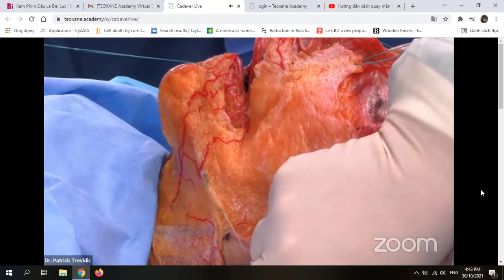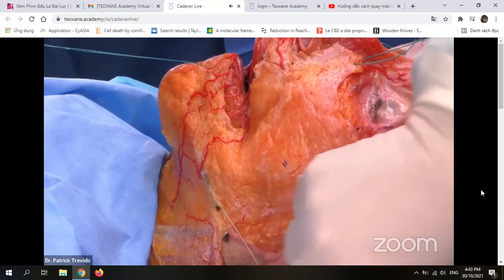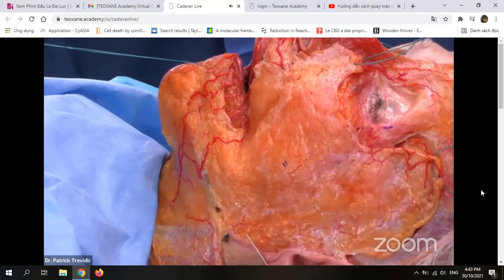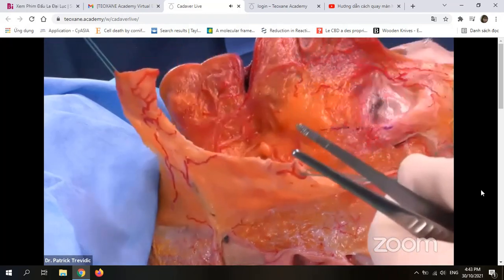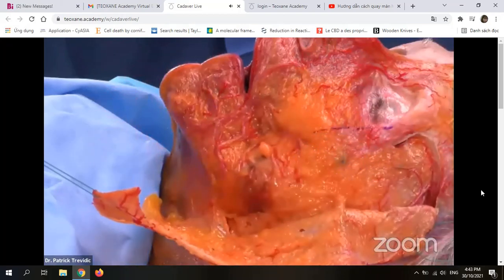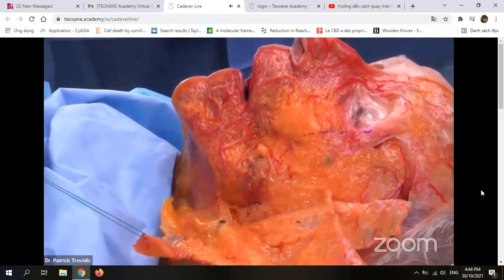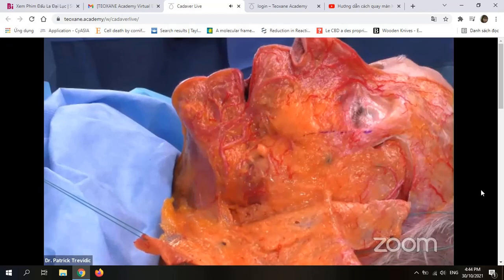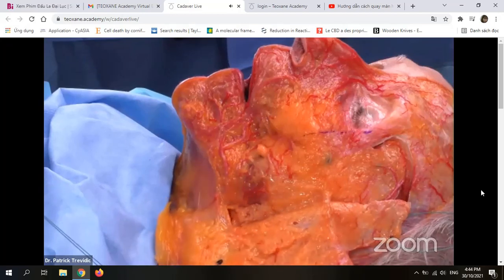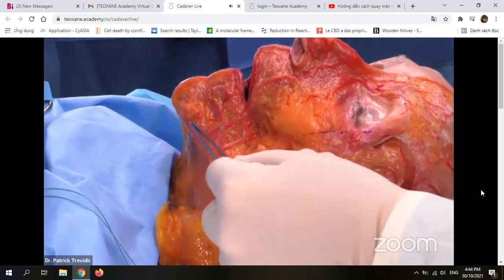You see the blue coming, very superficial, and with my cannula. So I did my superficial injection with my cannula, and then I will show you that the blue was inside, as you can see here, if we zoom a little bit, was inside the fat here. So my cannula put the HA superficial to this area, to this line, and it will be the same for the anterior injection that Nabila did.